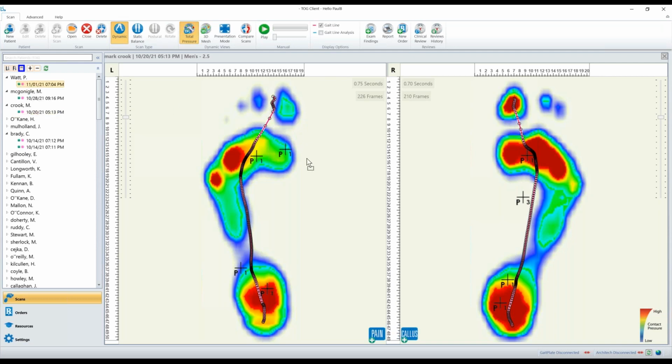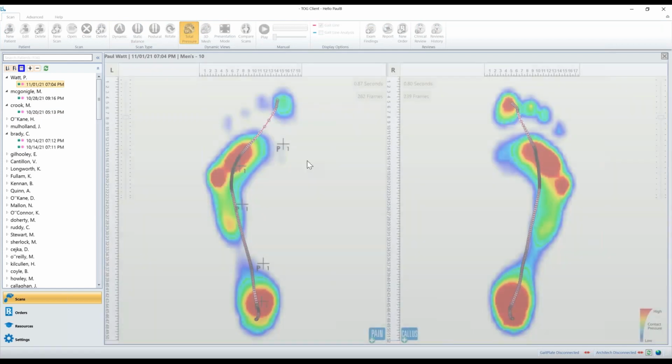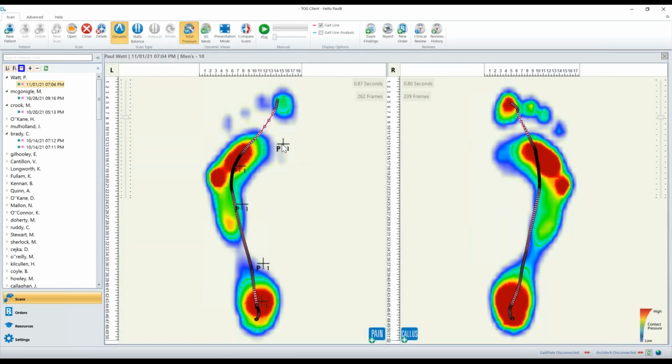What you have to look out for is the case of this. Now again, very little big toe. But this is a different one, because this patient came into me with no movement through the first MTP joint at all. This patient has seen so many practitioners, they have been getting work done on their IT band, work done on their hip, they've had x-rays on their hip. This person just has no other way to walk except to externally rotate.